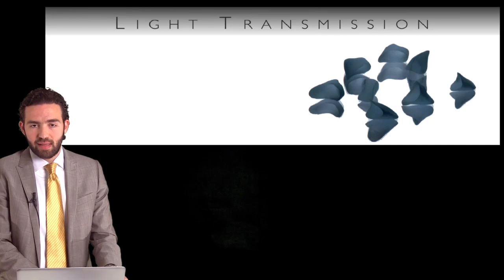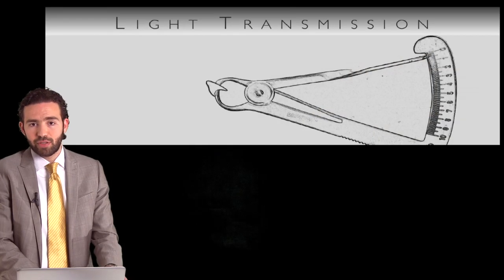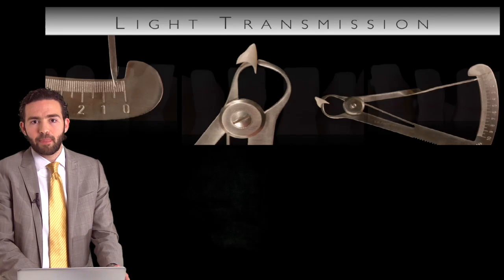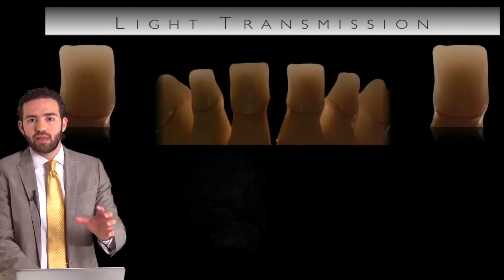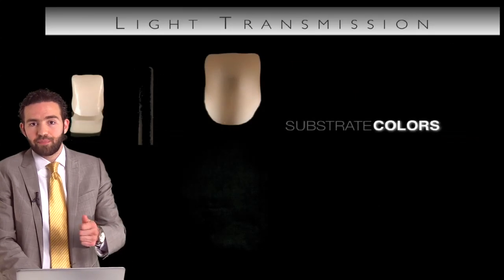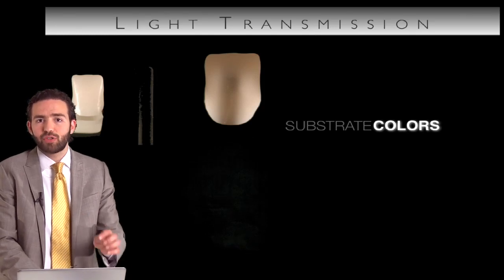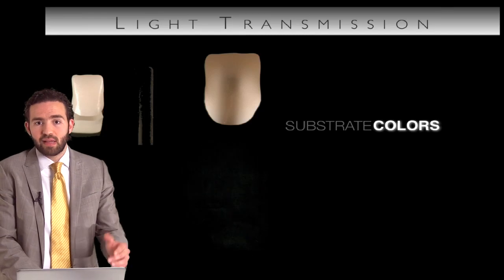Now, we tried to demonstrate the concept of light transmission through a case where the copings have been measured, and in the midsection you see the coping thickness is about 0.4 to 0.5 millimeter. We put those copings straight on the dies and shoot some light from the backside, and you see how the light is being transmitted through, and you see the outline of the stone die through the zirconia coping. That's very interesting, isn't it? We also put some black plastic cylinders right under these copings and shoot some light from under it, and you see the black cylinders showing through as much as possible.